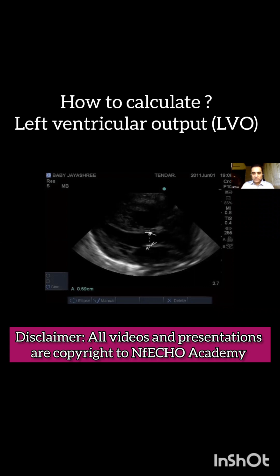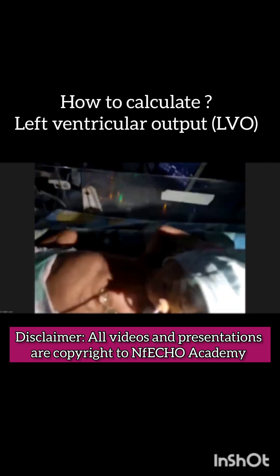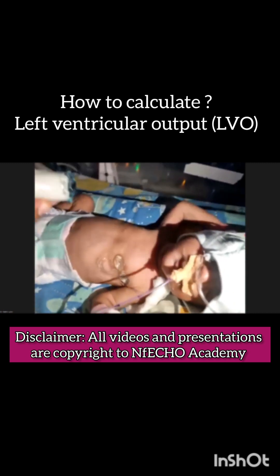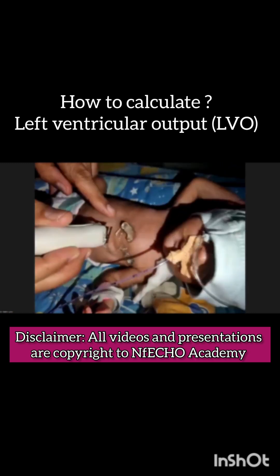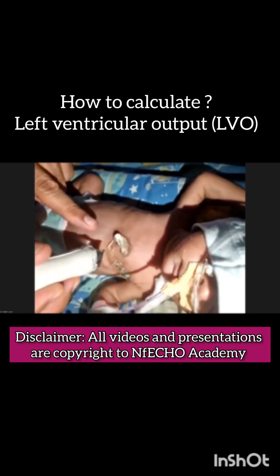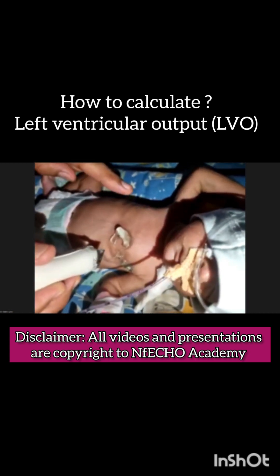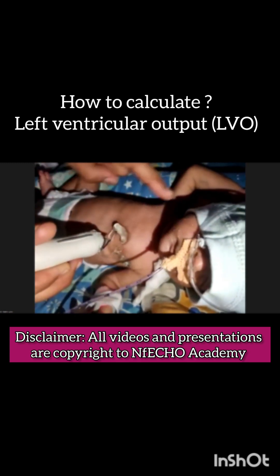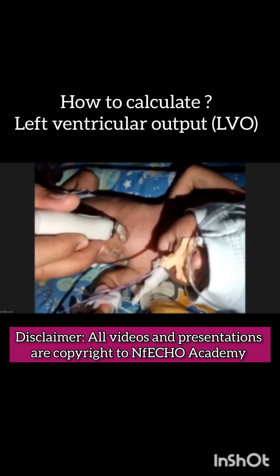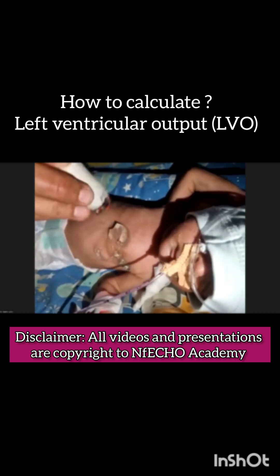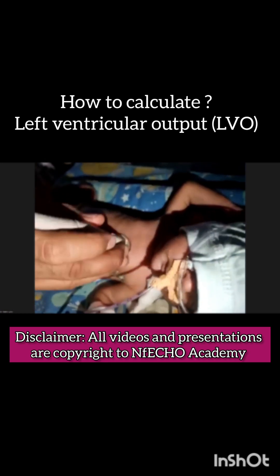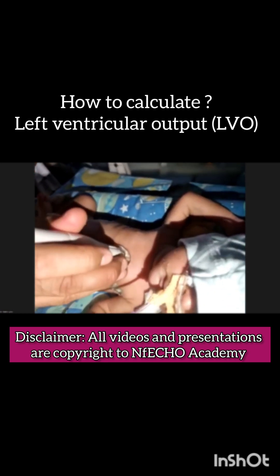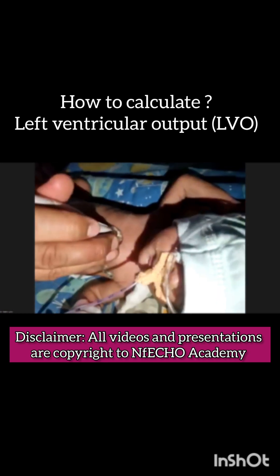As shown in this demonstration, you can see from which point to which point the aortic diameter is being taken. Similarly, you can see how to obtain the parasternal long axis view on the baby — at the nipple line, just to the left of the sternum, with the probe pointer directed toward the right shoulder at the 11 o'clock position. You will see the parasternal long axis view on your echo screen, in which we can calculate the aortic diameter.